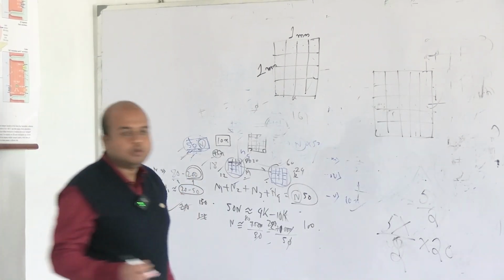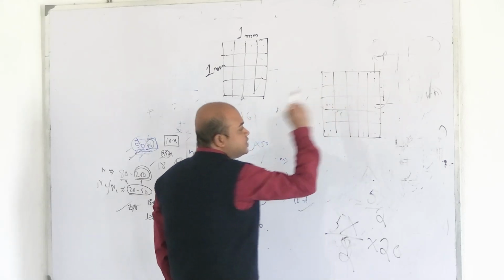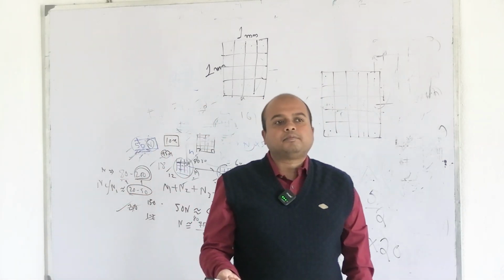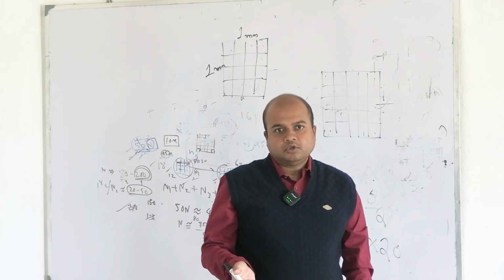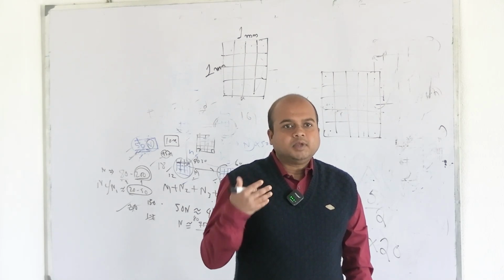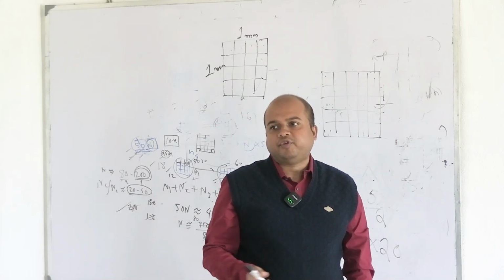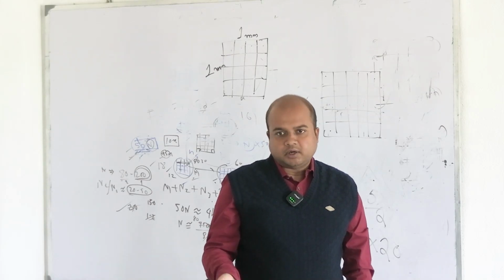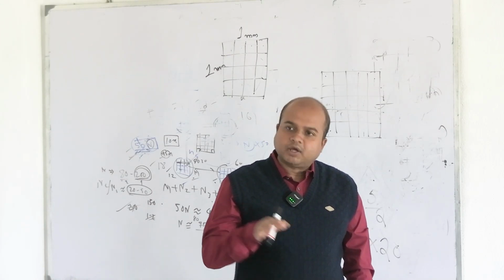So what do you do? We count the 4 corner squares and the central one. Now, you may say instead of 5 we could count 10. So, instead of counting 5, if we count 10, instead of counting 10, if we count 15, then perhaps our result will be more accurate. But to keep things practicable, we count this 5.